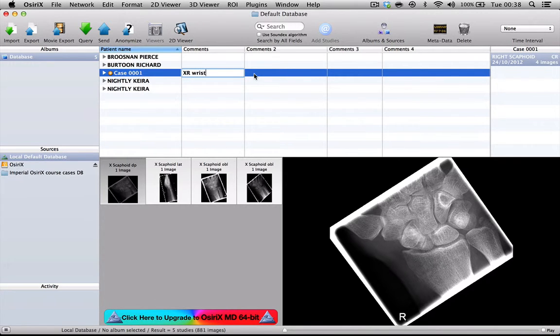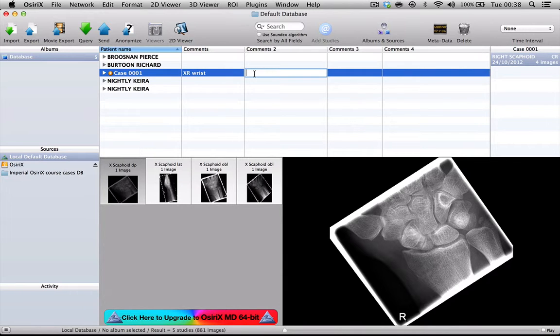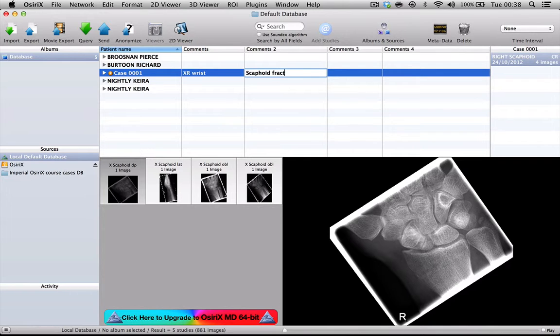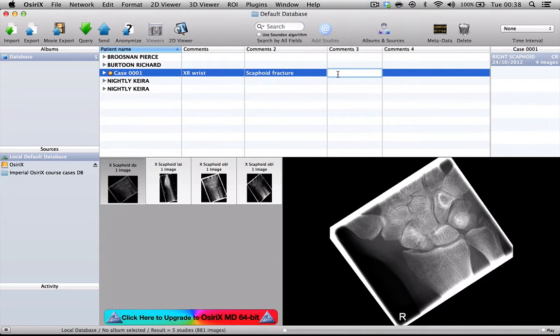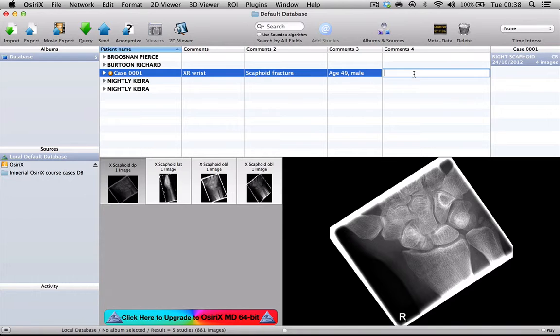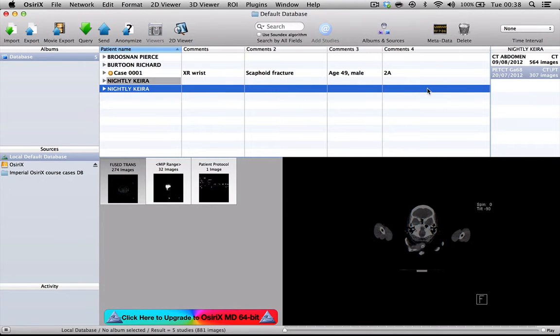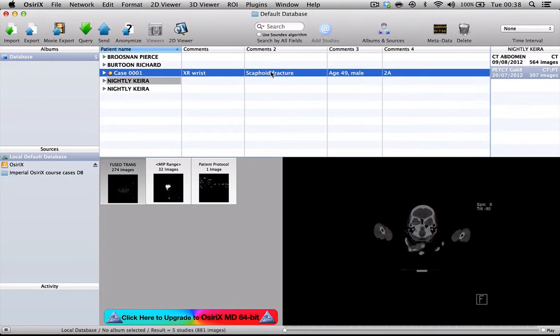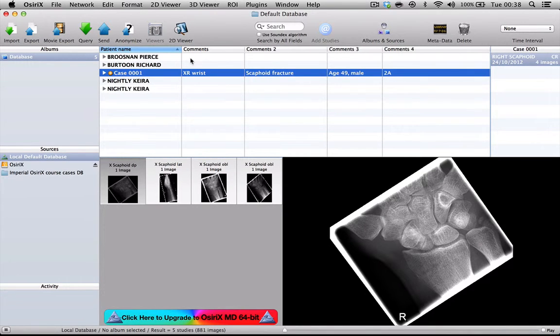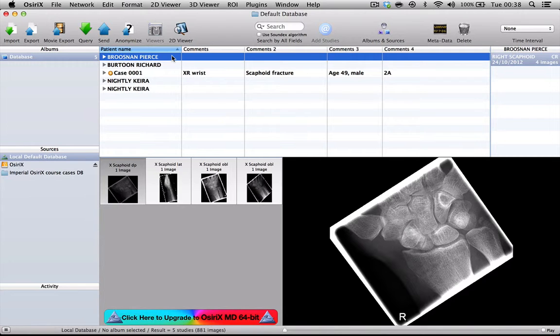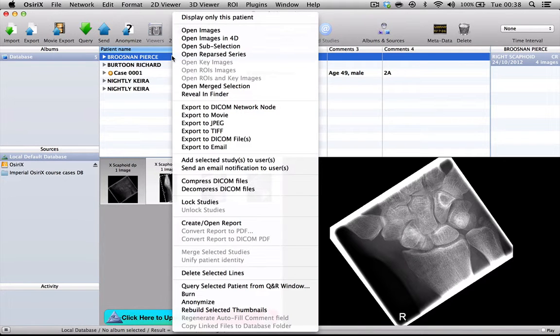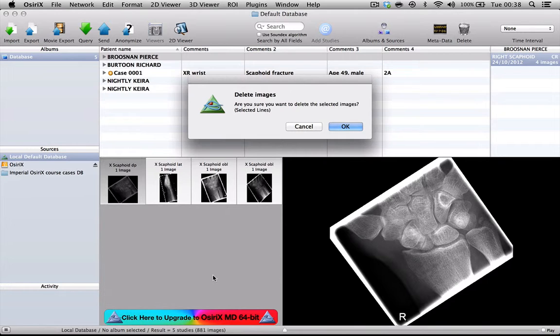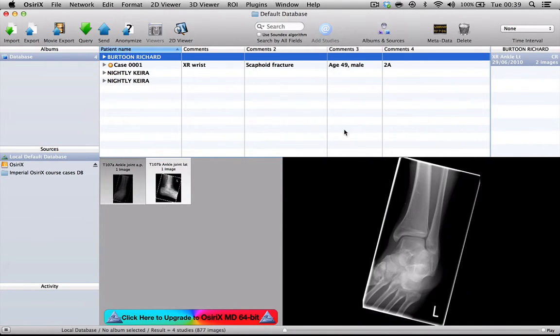The modality and the area, the diagnosis - this is a scaphoid fracture. We're going to put the age of the patient, he's a 49-year-old male. Then we're going to put the RCR code for the syllabus, which is 2A. And there is our anonymized case. At this point, it's safe to delete the unanonymized case. So that's one way of anonymizing a patient.